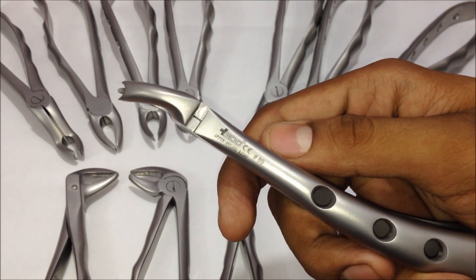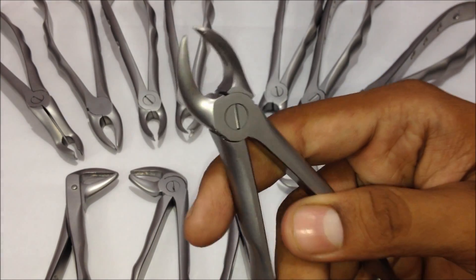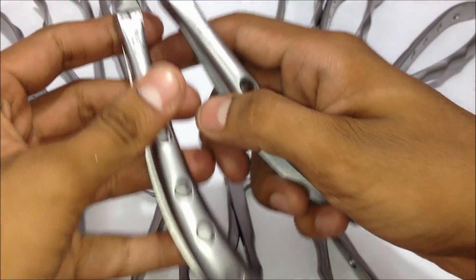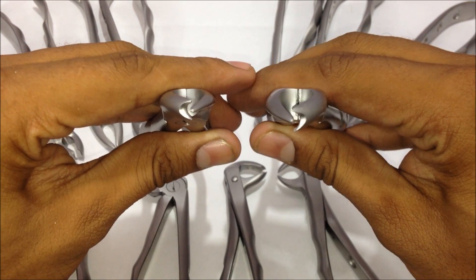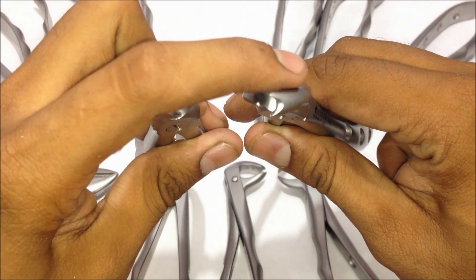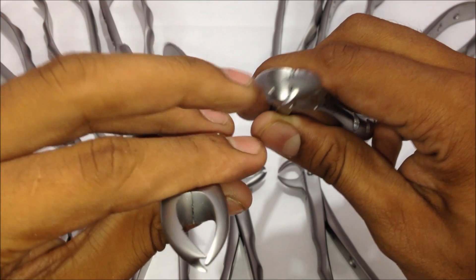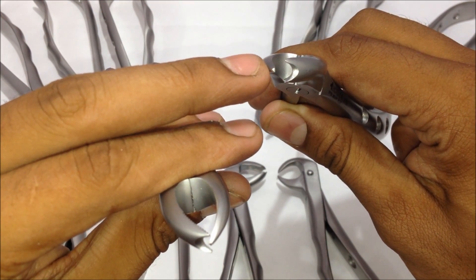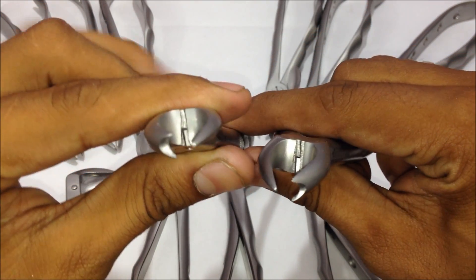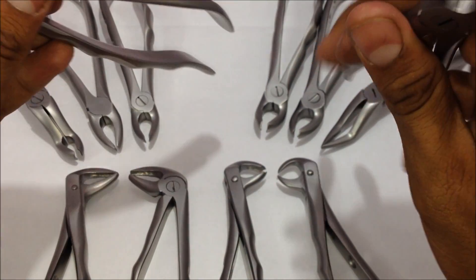The number 89 is a similar forceps to the 90, but used only for the right upper molars. The difference is that the beaks are located at an opposite angle — the two-headed beak is on the right side, which is the patient's left side, and the one-headed beak is on the left. That is the only difference between these two forceps.